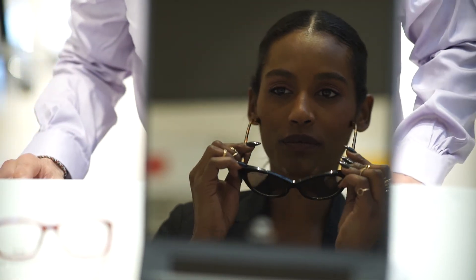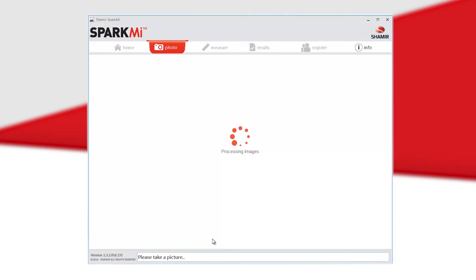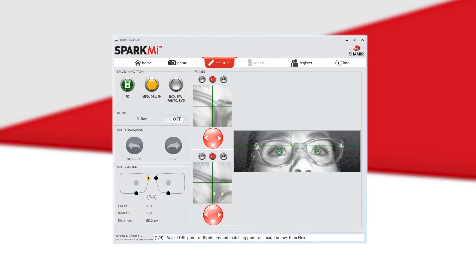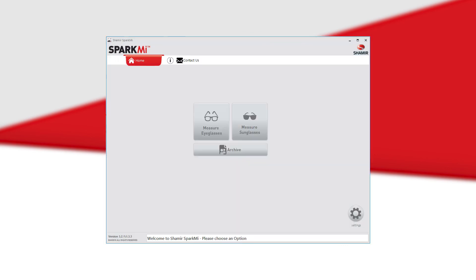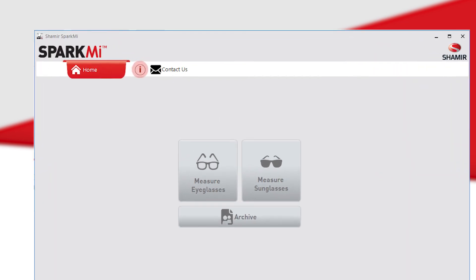With SparkMi, the patient can wear clear, dark, and even some mirror lenses. If you would like additional help, the SparkMi manual and video tutorial can be accessed from any screen by clicking the info icon.